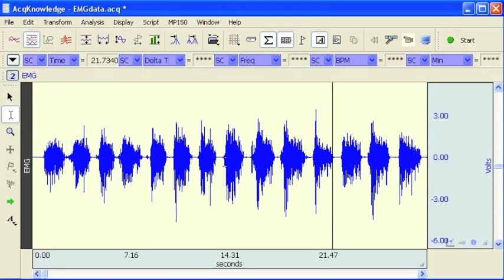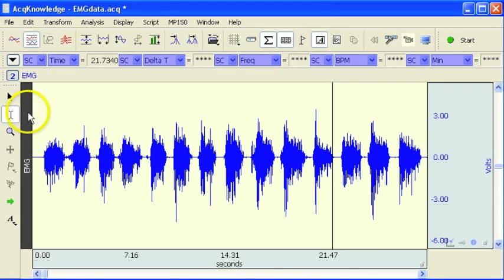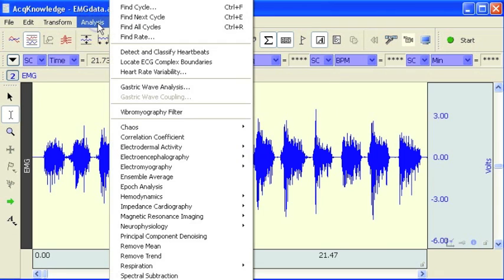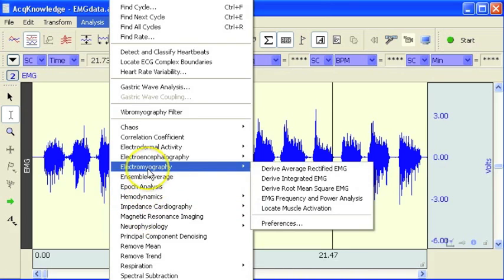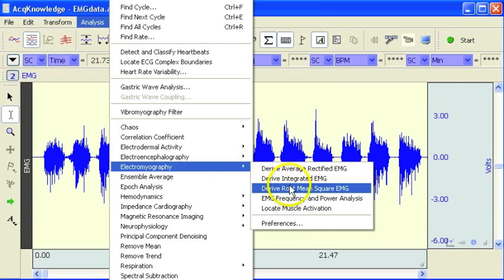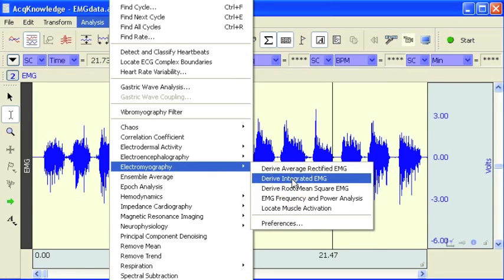The following screencast will demonstrate the Acknowledged, Derived, Integrated EMG Automated Analysis Routine. Here we have a raw EMG recording. This data was sampled at 1000 samples a second. This particular analysis routine is located under the Analysis menu, Electromyography menu, and Derived Integrated EMG.